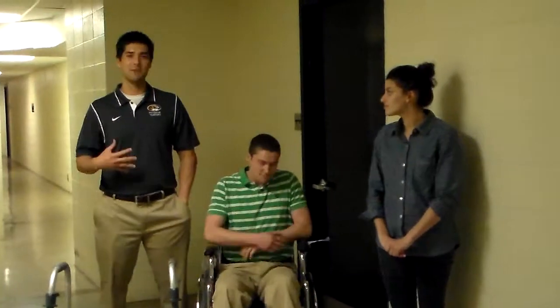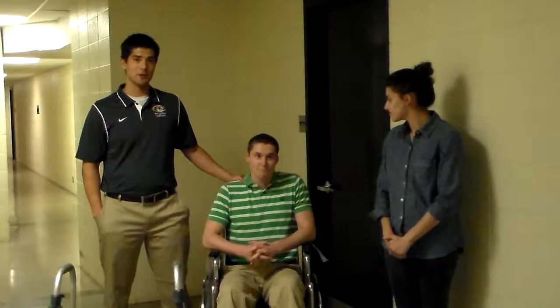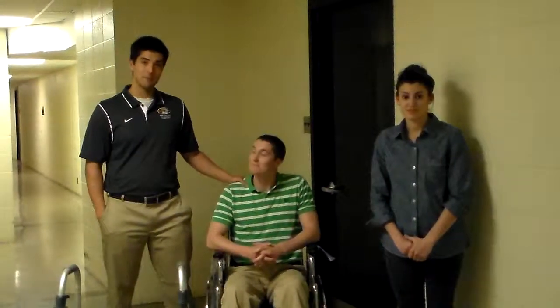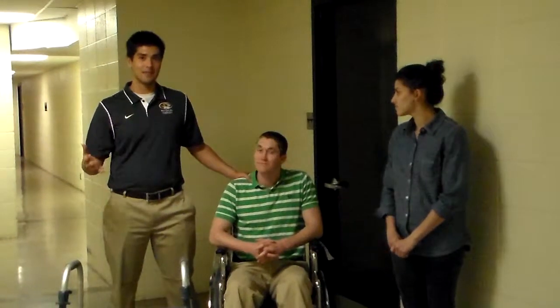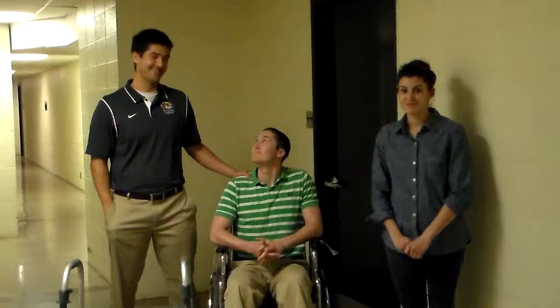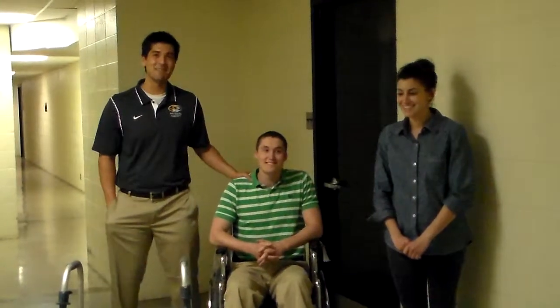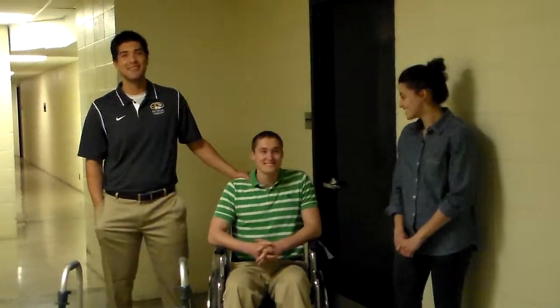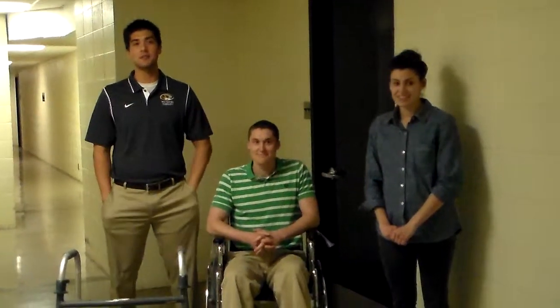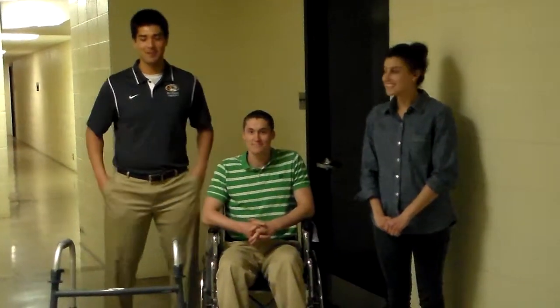Hello to our students. My name is Matthew. I'm Lindsay. And today we're going to teach you how to use the walker with Kevin as our assistant. So Kevin is portraying Pat, a 67-year-old left hip fracture patient. And we're going to show him how to use the walker and teach him the proper gait pattern.